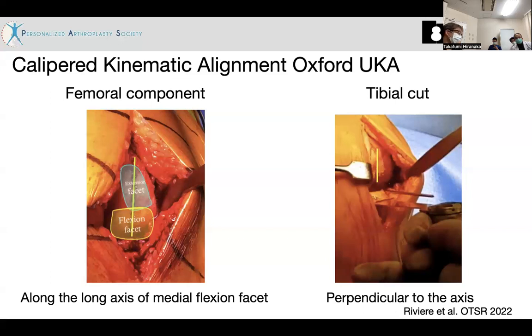Theoretically, it's a very good procedure, but it is quite difficult too, because we should cut the tibia freehand, without an instrument. So it's very difficult.